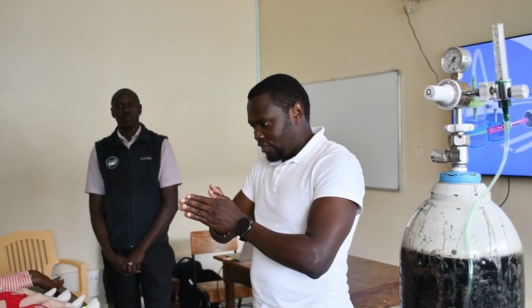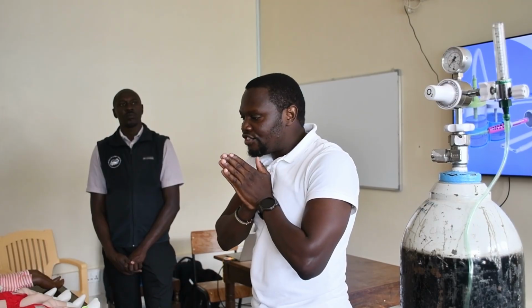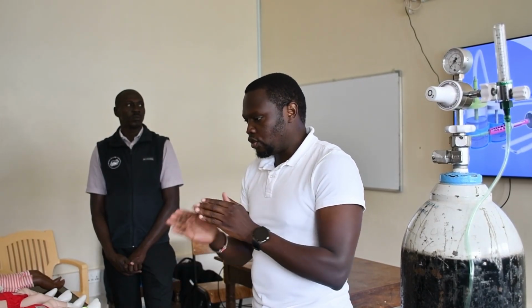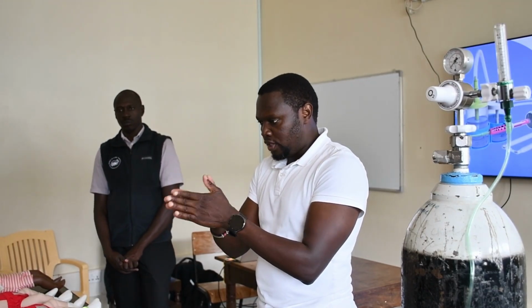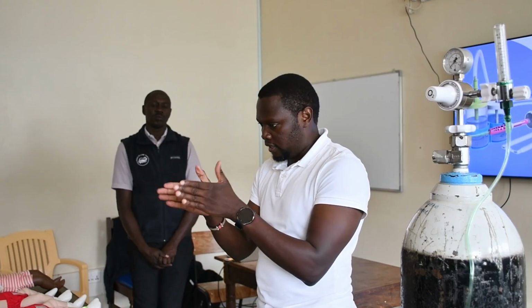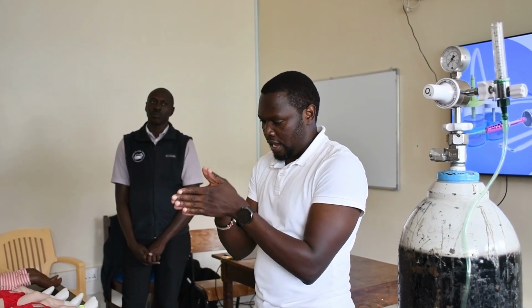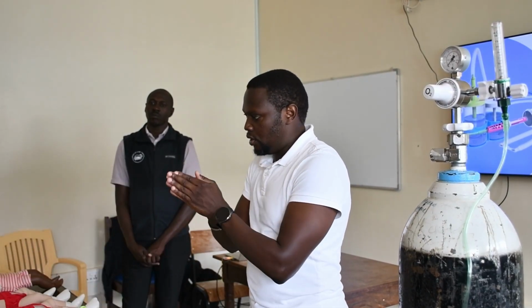The moment you let it go down completely, that's when they have a lot of vacuum breathing. They are really trying hard to open up. So this is just to maintain that pressure, so that they are not losing anything. It is something that is being retained in their alveoli as a residue, so that every time this is coming in and they're trying to breathe out, they just go back.